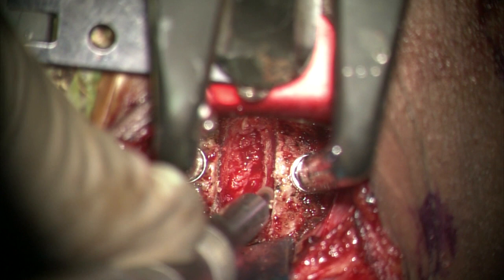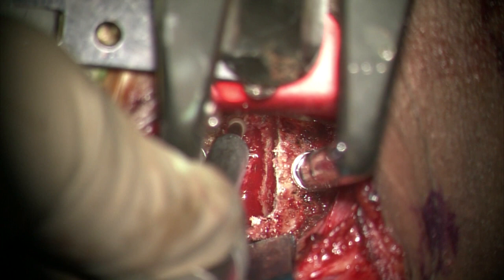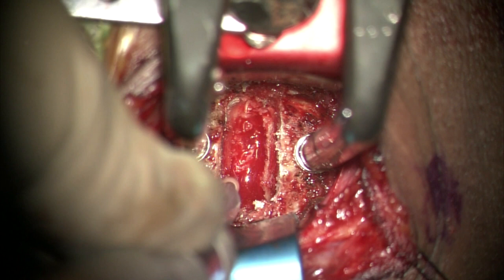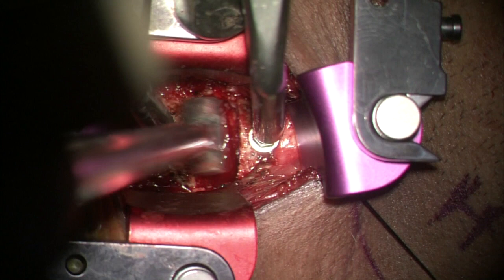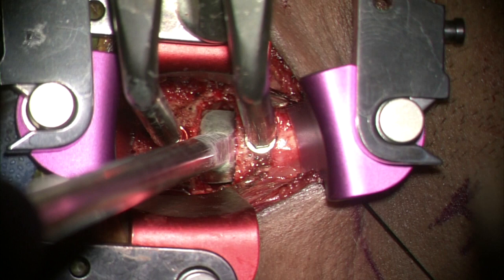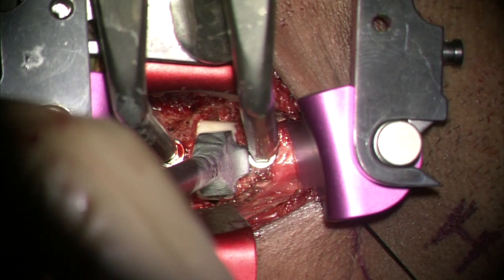The endplates are decorticated using a 3mm coarse diamond burr or a curette, with the ultimate aim of flattening the smile-shaped disc space and converting it into a rectangular box. Osteophytes, if found, can be removed at this stage. A sizer is used to determine the graft or cage size, and the distraction on the Casper pins should be released in order to assess the fit of the sizer.